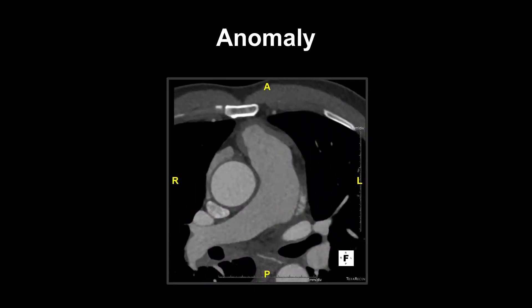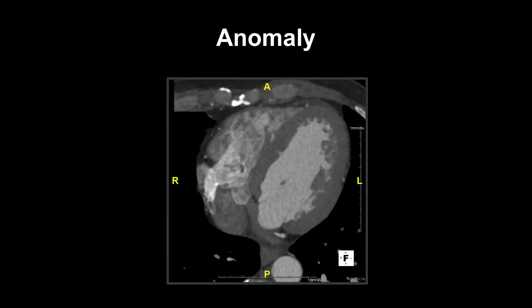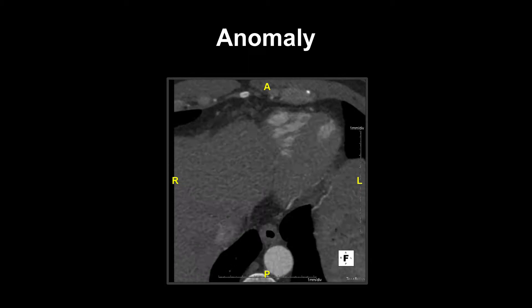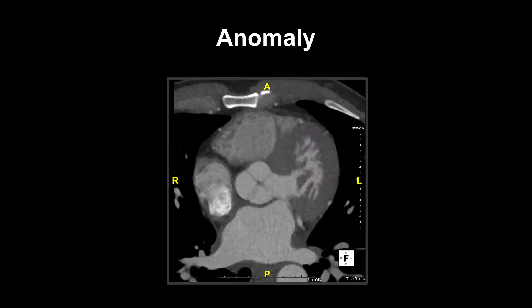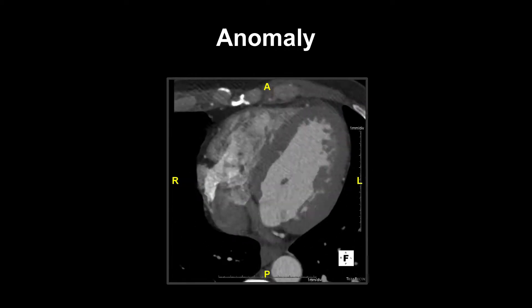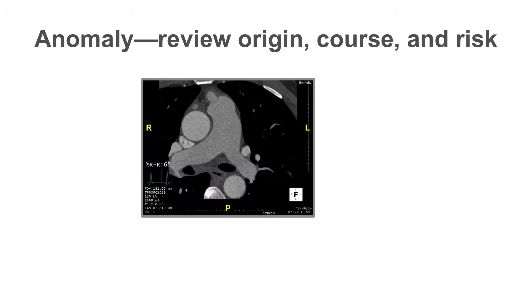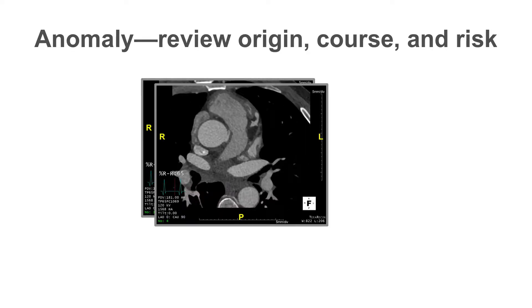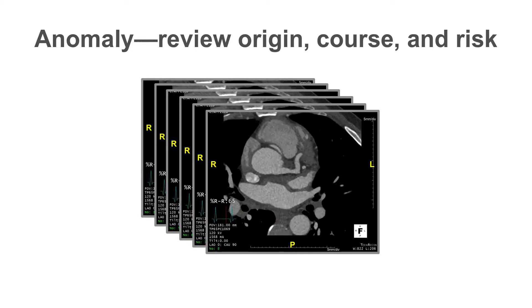Are you able to spot the anomaly on this scan? Look very closely as to where the right coronary artery originates from. When looking at anomalies, be careful to look at the origin of the vessel, its course, and evaluate the potential risk. In this case, just below the main pulmonary artery, the right coronary artery can be seen emerging from the left coronary cusp. It then follows an inter-arterial course, and this particular variant is considered to represent a malignant coronary artery.